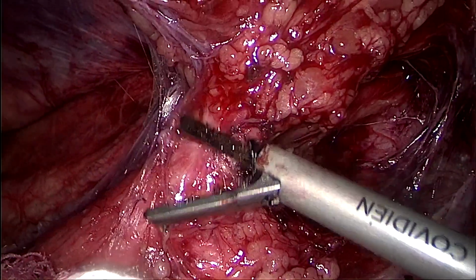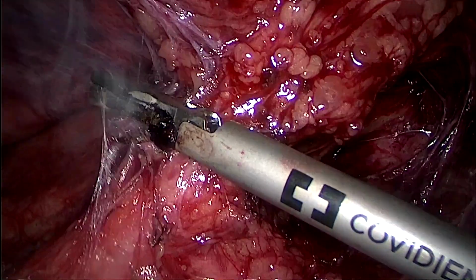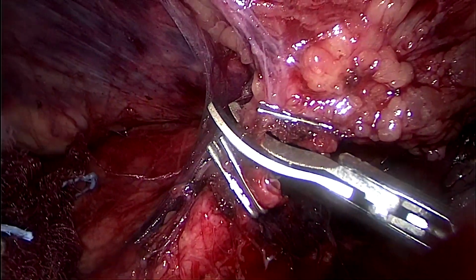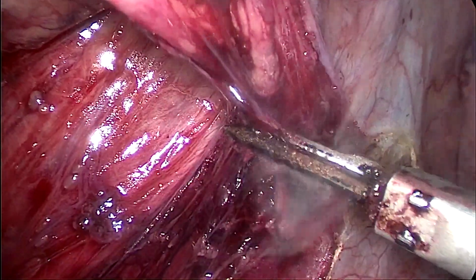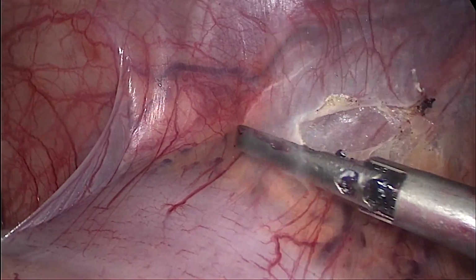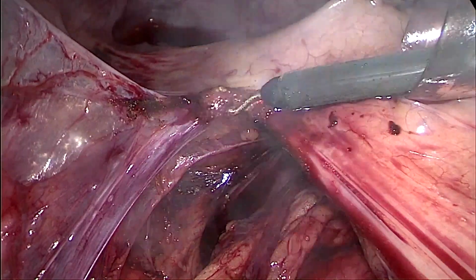Here we are going to ligate the inferior mesenteric artery. So we are moving from the right side to the left side, already having performed the transverse colon. Now we ligated it and we put the artery up, and then we resect it to the posterior part, where we're going to find the ureter in the retroperitoneum area. Notice that the colon is already without vascularity.